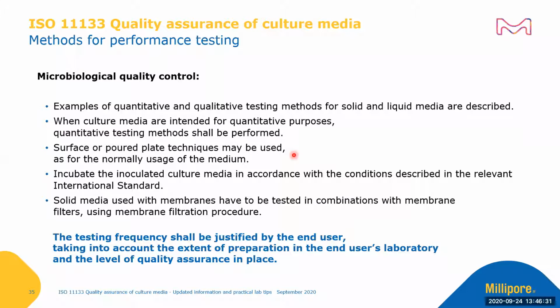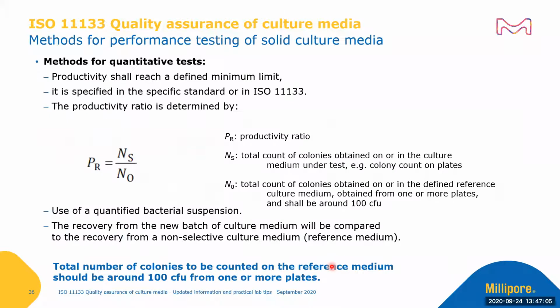Surface or pour plate technique may be used as for the normal usage of the medium. Incubate the inoculated medium in accordance with the relevant international standard. Solid media used with membranes have to be tested in combination with membrane filters using the membrane filtration procedure. And the testing frequency shall be justified by the end user, taking into account the extent of preparation in the end user's laboratory and the level of quality assurance in place in the laboratory.